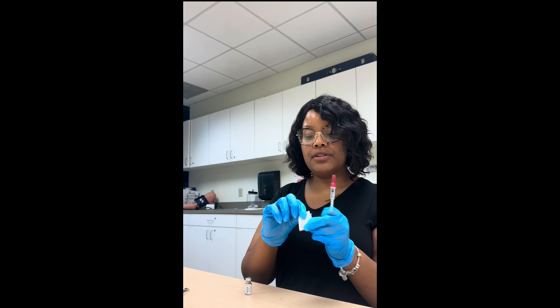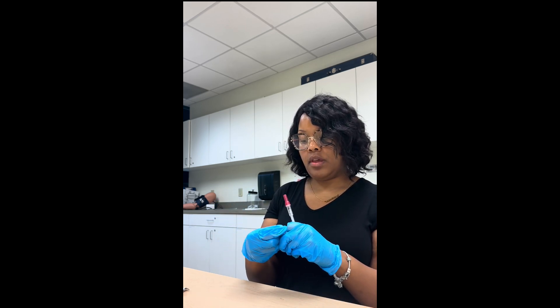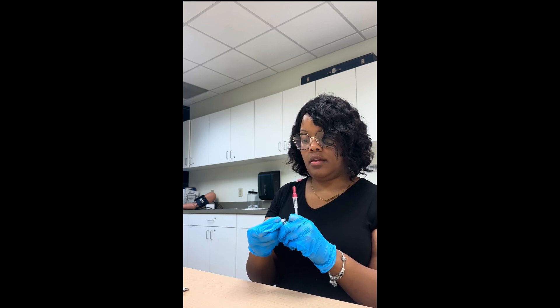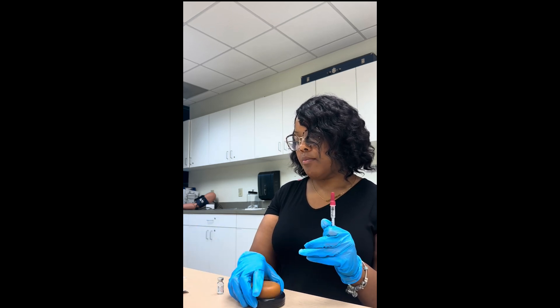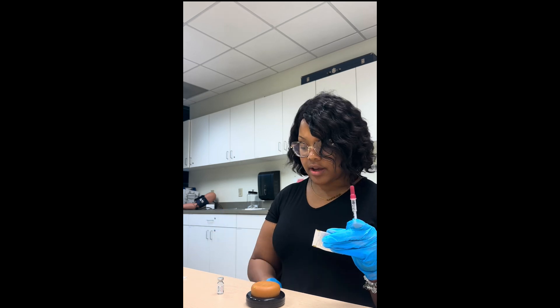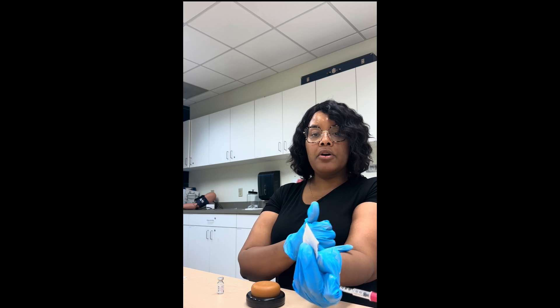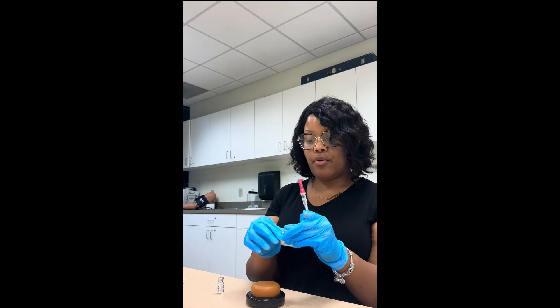I have my alcohol wipe. Knowing this is a multi-use vial, you're going to have to clean the hub of it. Then we're going to cleanse the patient's skin. Where am I going to do the skin test? Right there on their forearm — either arm is fine.